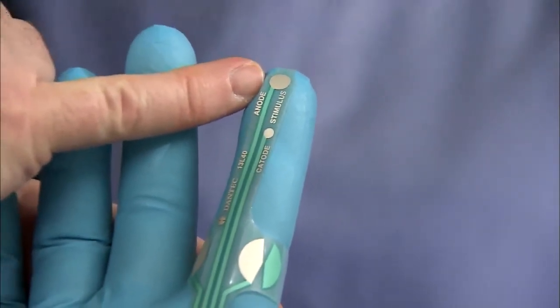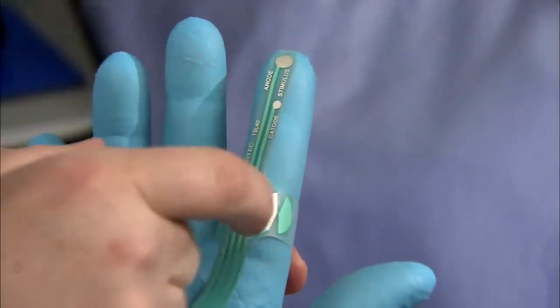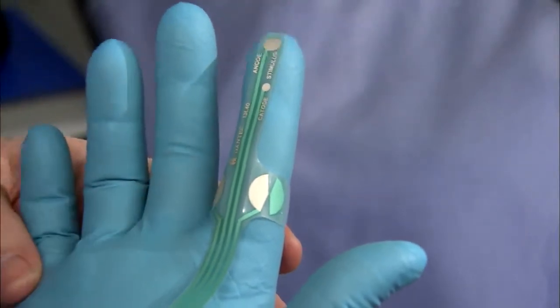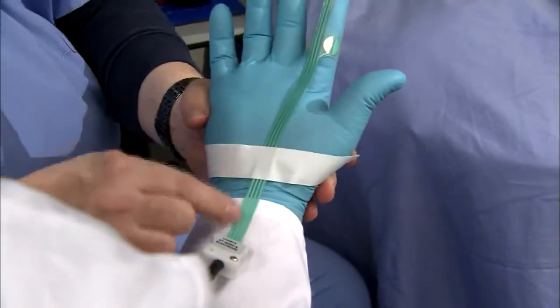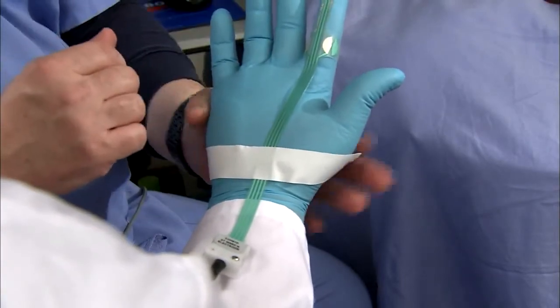Notice where the stimulus electrode is. It's on the pad of the index finger, and then these two tabs must wrap around the index finger to be able to get the proper location when you're actually doing the test. It's also a handy idea to just go ahead and put a piece of tape on the far end of the electrode that just helps stabilize it when the physician's doing the exam.